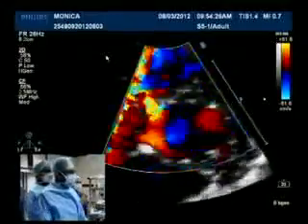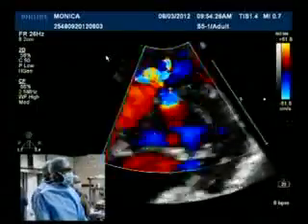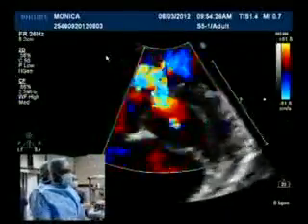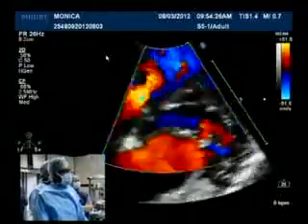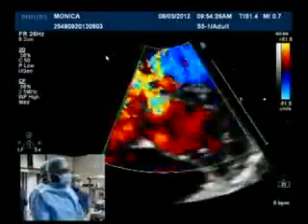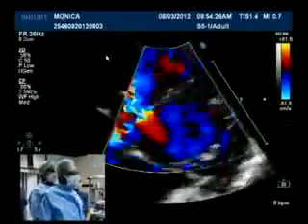So in our experience, we use a muscular device in case of a membranomuscular junction VSD, or alternatively we will form an AV loop and then you can use the ADO1, that is a duct occluder first generation. But I think this is a 6.5 millimeter defect, reasonably fairly straightforward. So we thought we'll select the case for the ADO2 deployment using a retrograde technique.